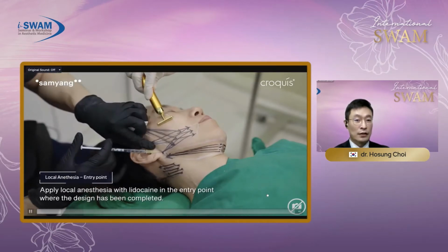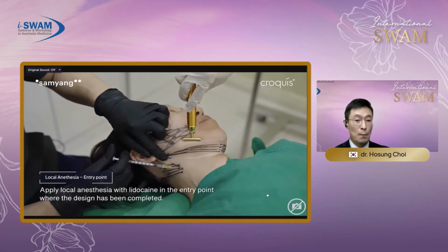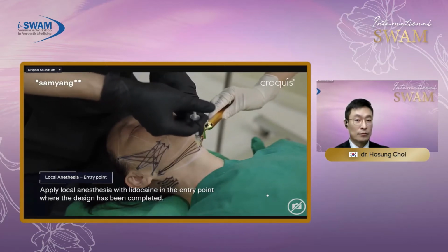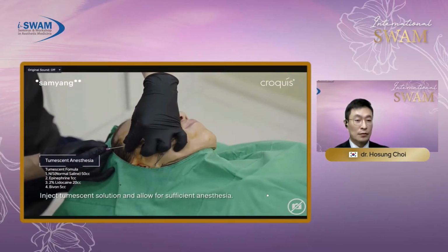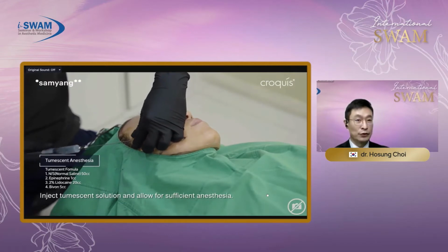Now I'm injecting lidocaine containing epinephrine on each entry point. After making skin puncture using 18G needle, I'm injecting tumescent fluid.